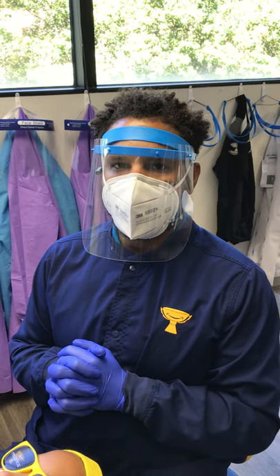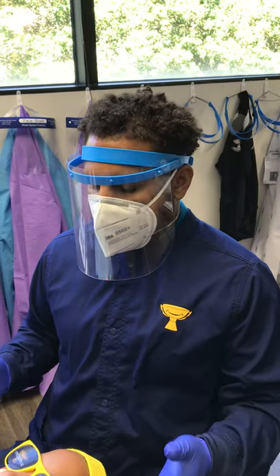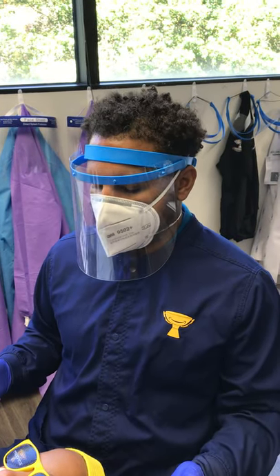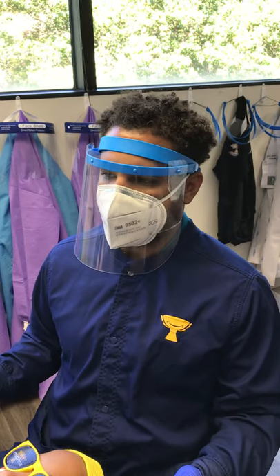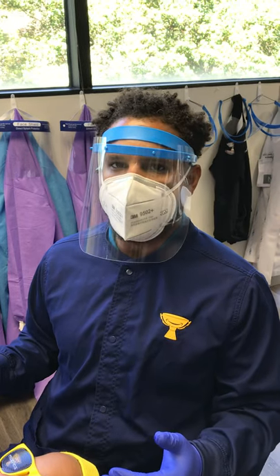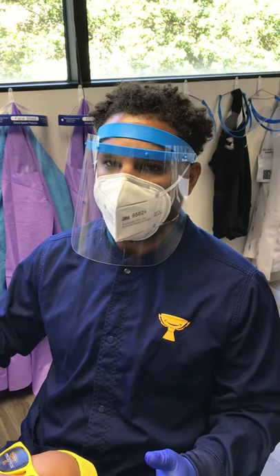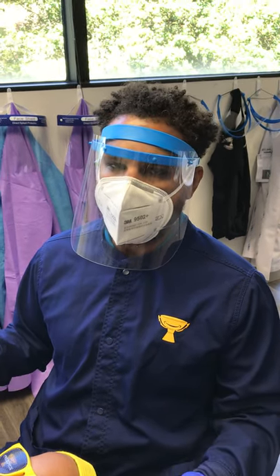We're going to go over fitting bands. We have our patient here — she's getting started with her treatment today. She's already been pumiced and etched, so let's quickly go over those two steps. When you pumice, you're basically just taking a prophy angle and pumice to clean the plaque and the pellicle from the surfaces of the teeth where bands and brackets are going to be attached.